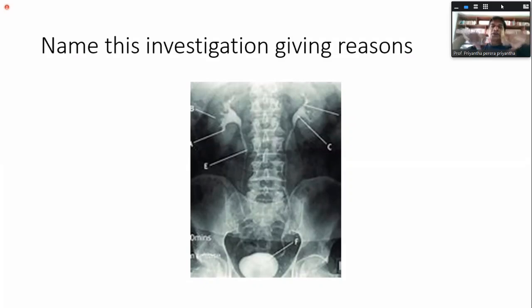But how does urine come down in normal people? In IVU, urine comes down passively, no? In MCUG, it goes up, right? But in urine coming down, how does it come? Like peristaltic movements, right? Some parts of the ureter will be in contraction, other parts will have urine passing.